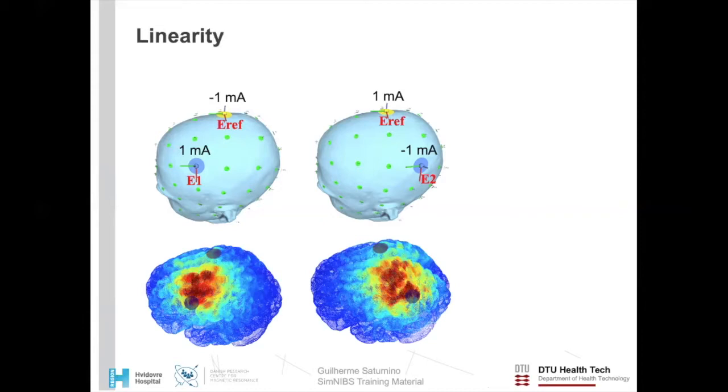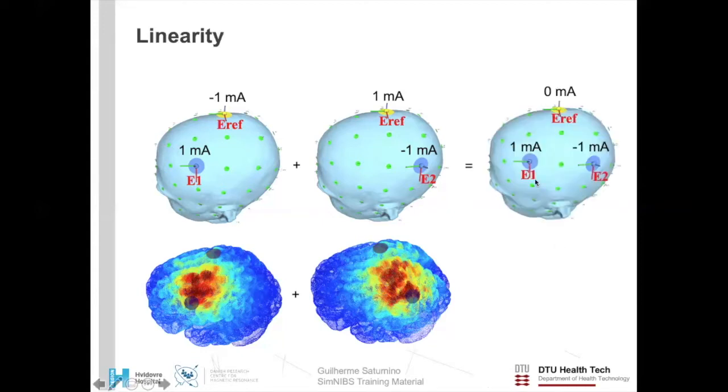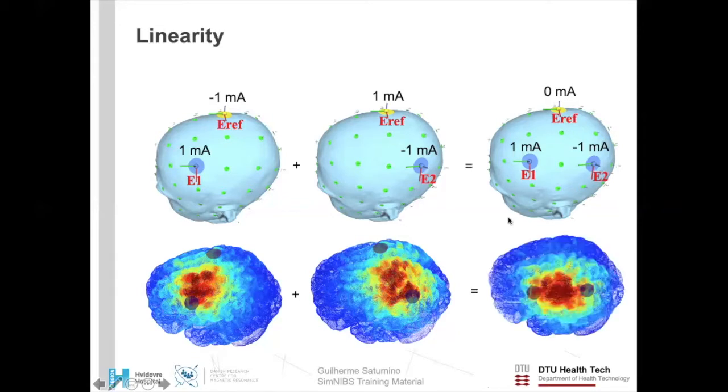Now, if I instead want to simulate the electric field that I would obtain by using the FC3 and the CP3 positions without CZ, I can multiply the second simulation by minus one and sum them. Now, the net result is zero current at CZ, and it goes completely out of the picture, as you can also see here in the electric field.